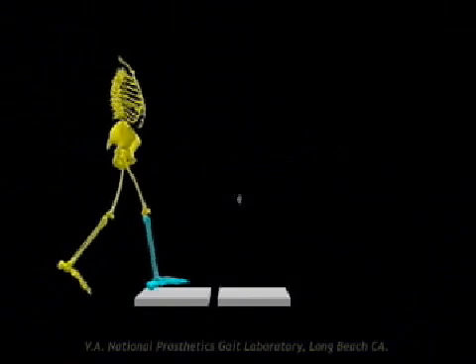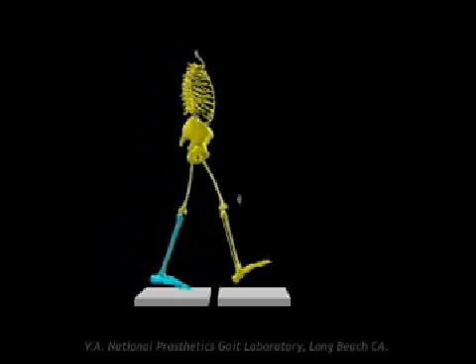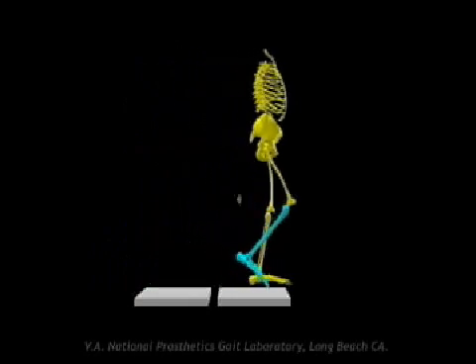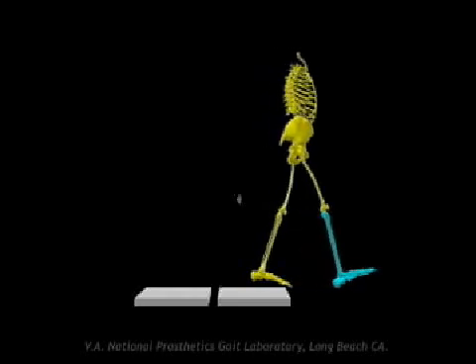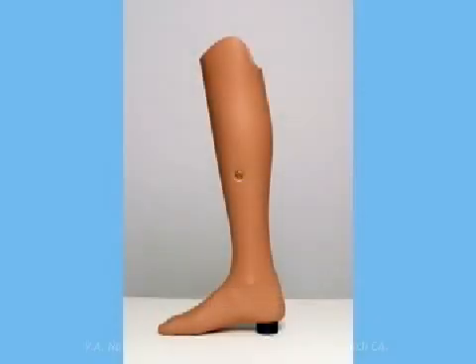To encourage knee flexion after initial contact, dorsiflexion of the foot and 12 to 14 degrees of socket flexion were historically recommended, but that is considered excessive by current standards. Most transtibial prostheses have approximately 5 to 7 degrees of socket flexion.